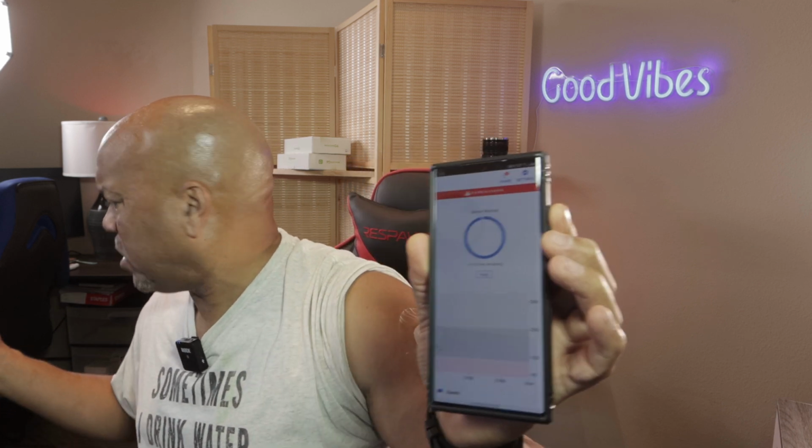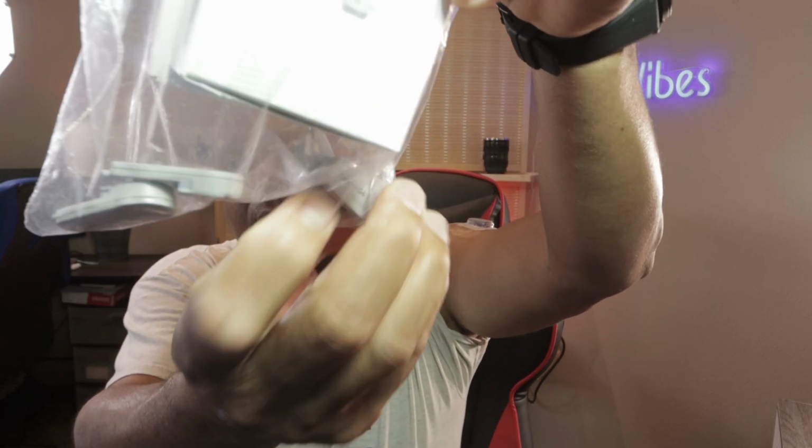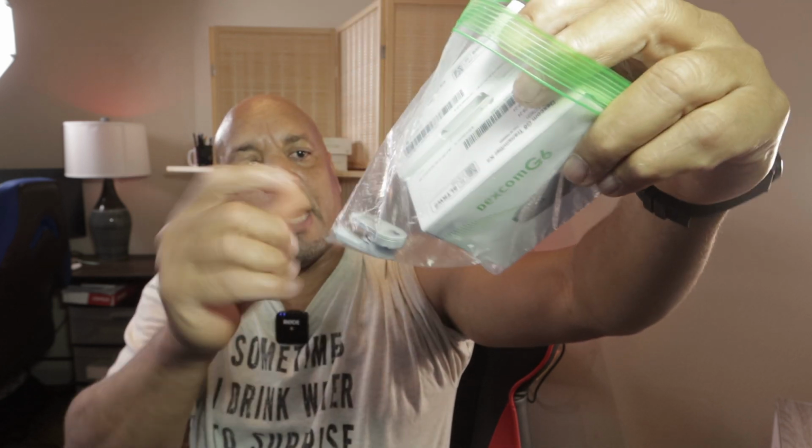And this is one of the reasons why I keep, if you look at the bottom here, you can see I have all these extra ones there at the bottom here. These are used ones. I put an X on some of them. I put a date on them sometimes. And a lot of times when I'm running out, which I never really do, I kind of just go in there and take one of these and reinsert it and use it again. You can reuse these, guys.